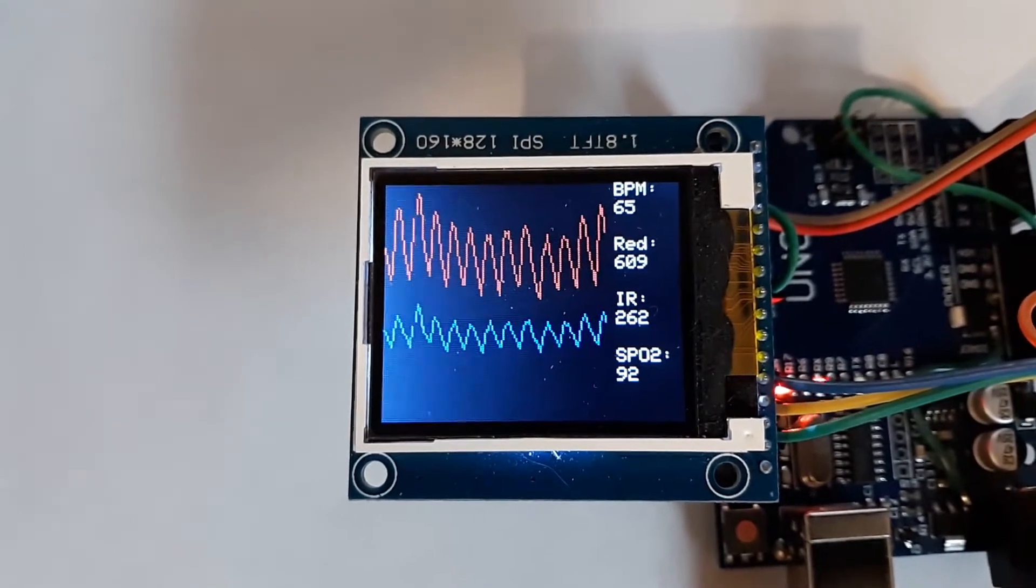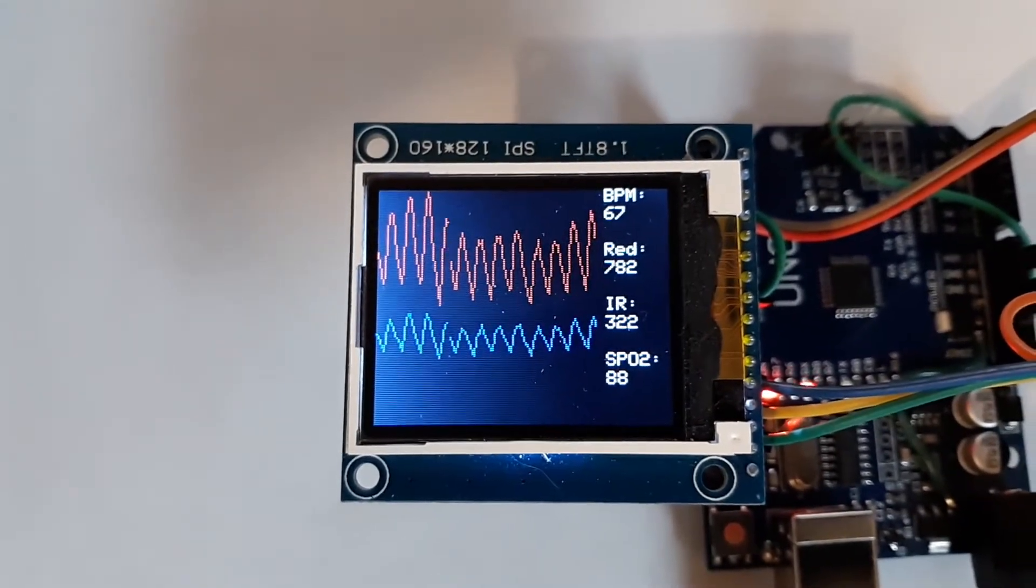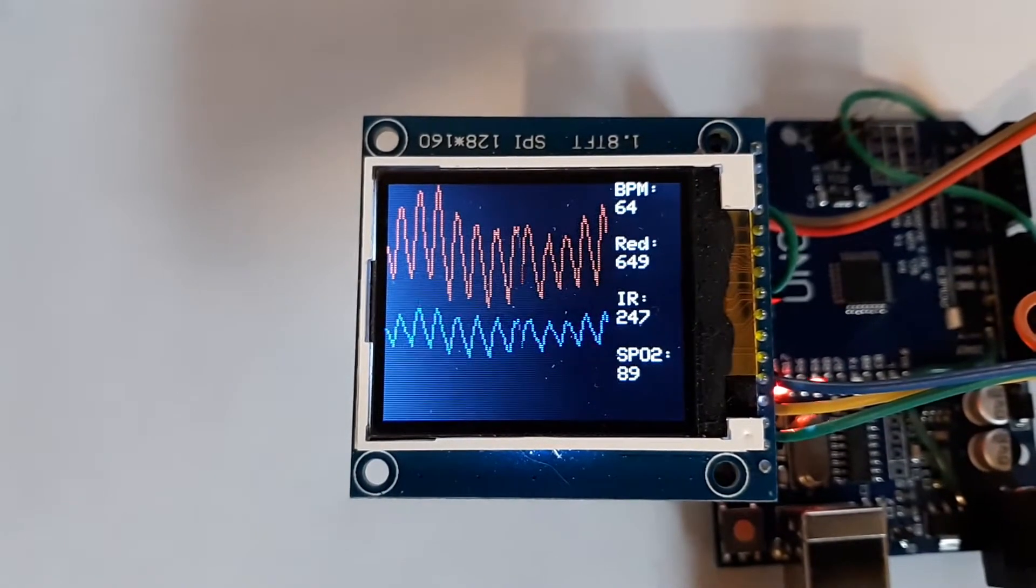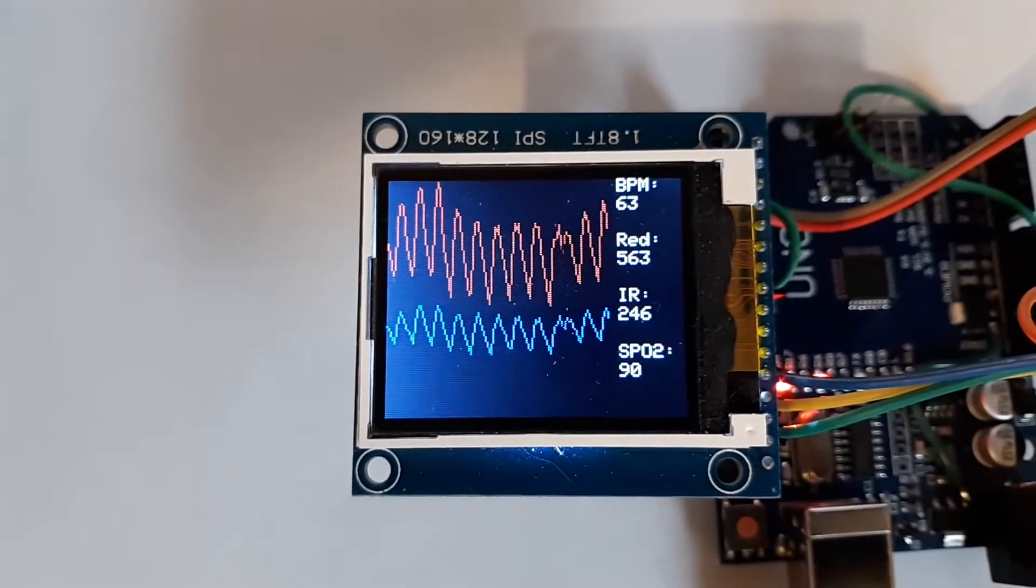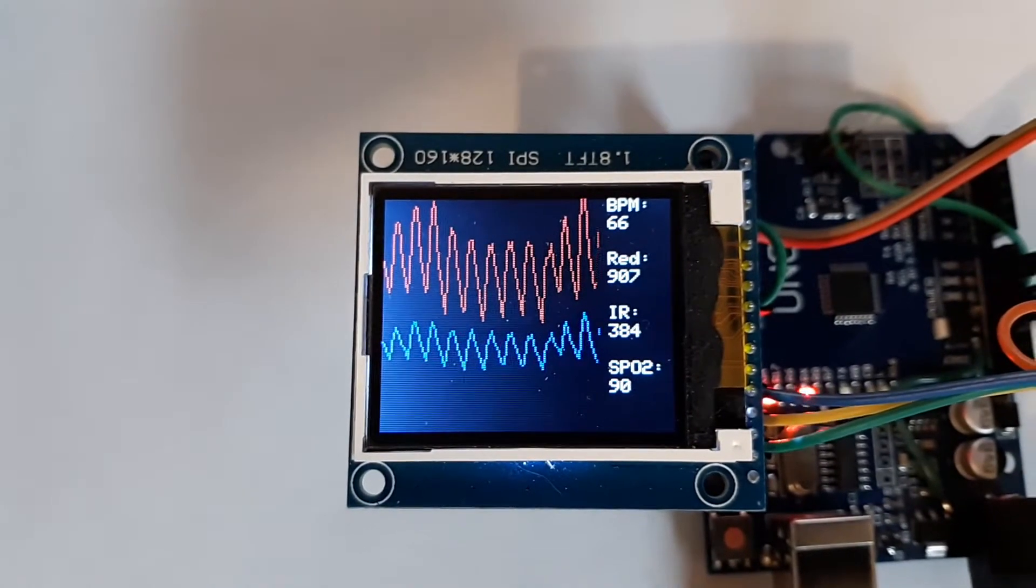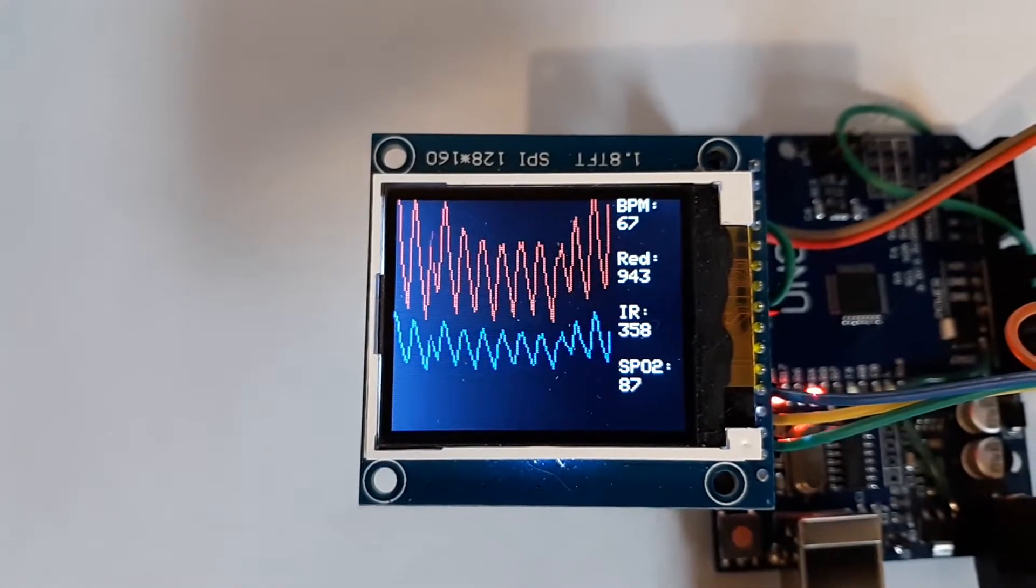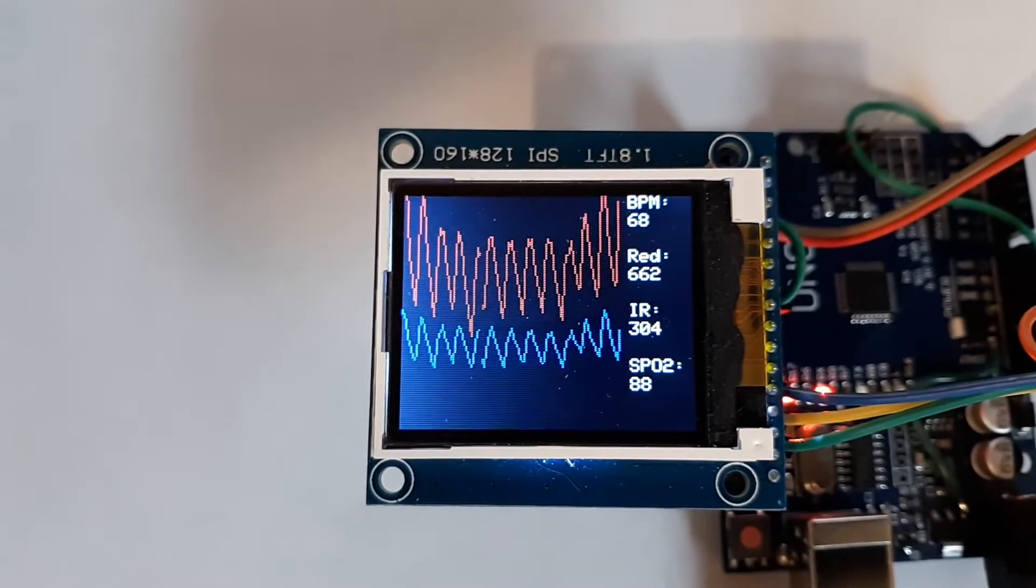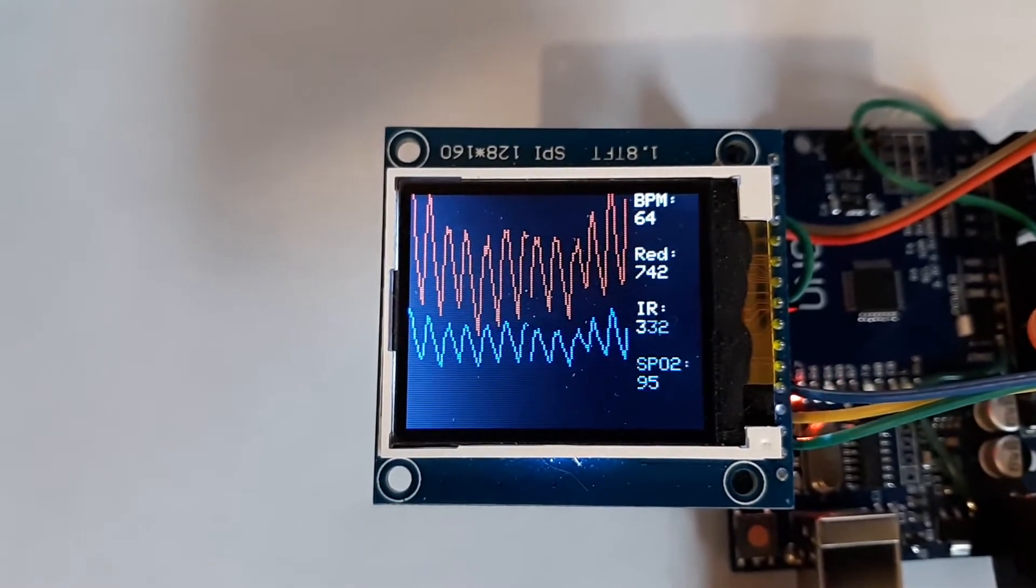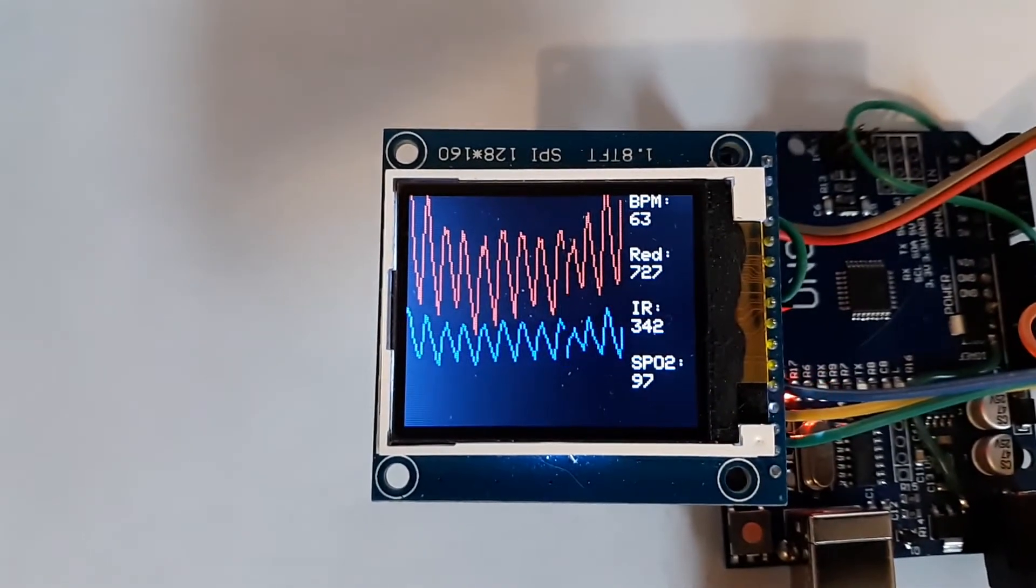The problem is my oxygen detector does not throw out bad readings - it accepts them right in. Unless you stay perfectly still so that the wave shape stays the same across the screen, it can't get a good oxygen reading.